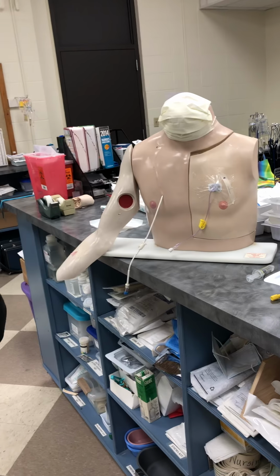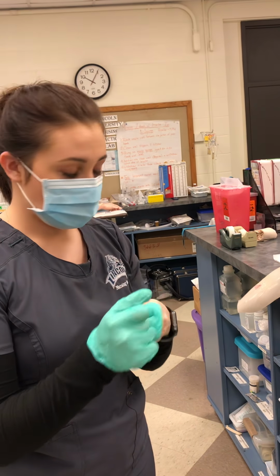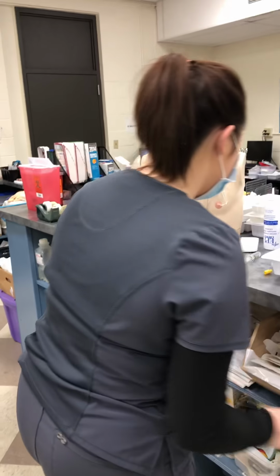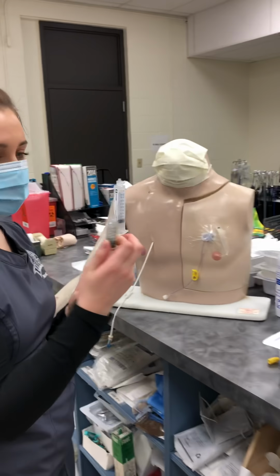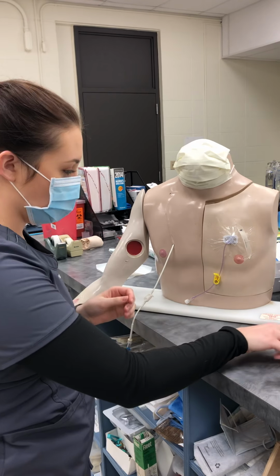And now I'm going to take off my sterile gloves, and I'm going to de-access the port. So again, you're going to need a 10 ml syringe of your normal saline and your 5 ml syringe of the heparin.